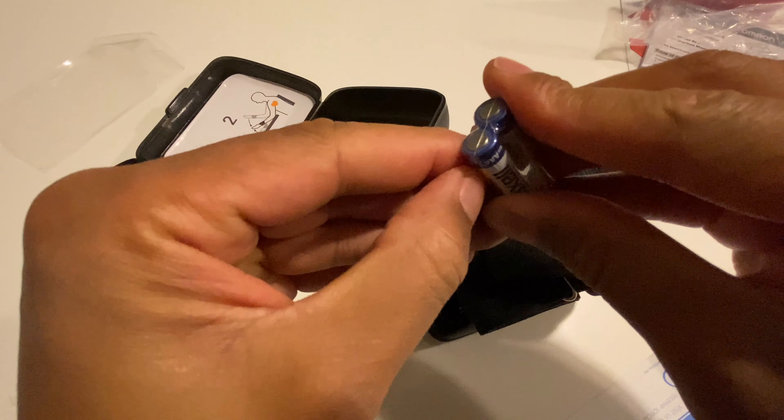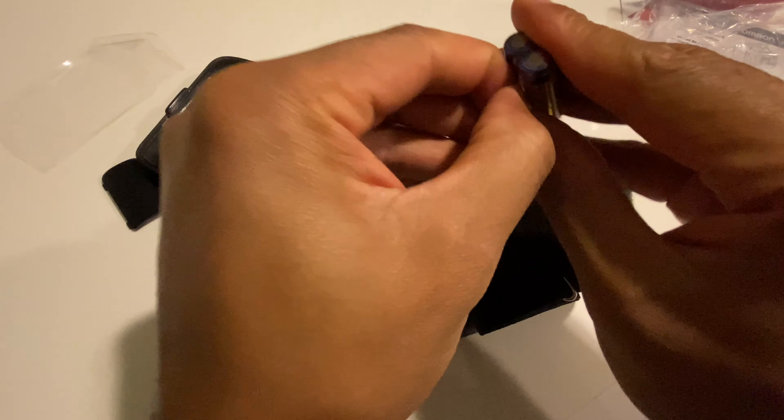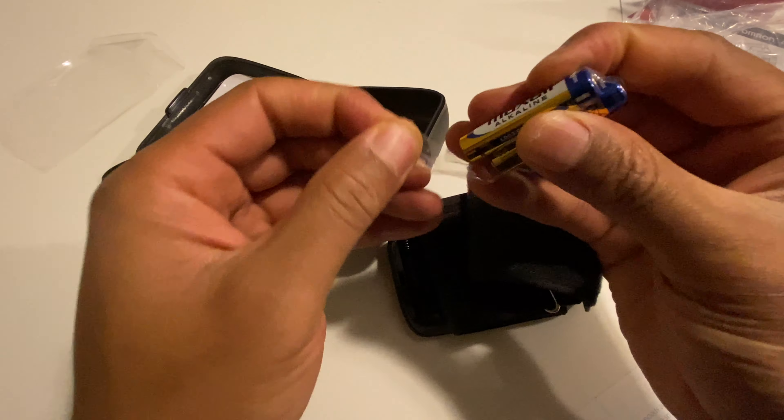If you don't have the batteries that came with it, you could pretty much buy some AAA batteries from your local store.